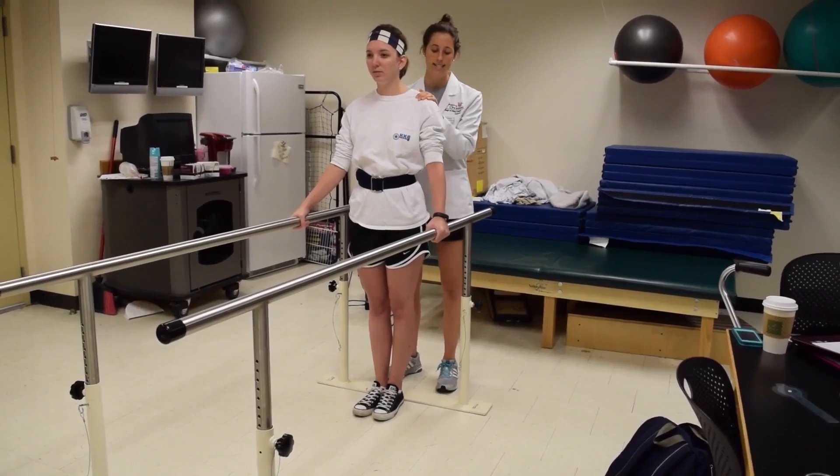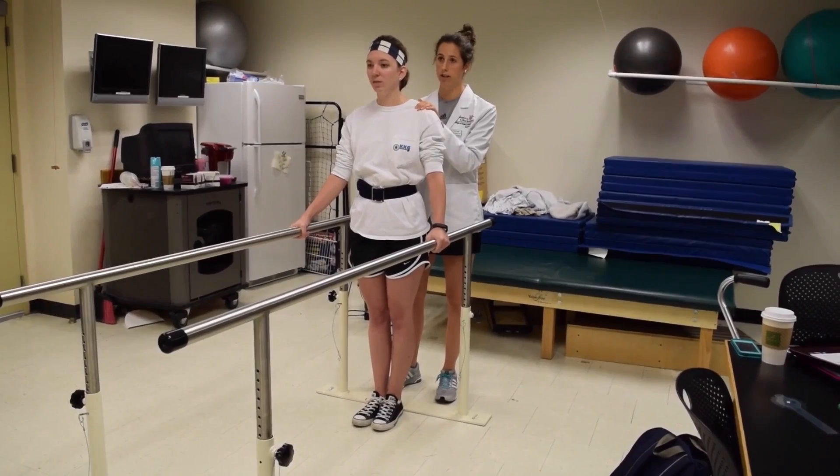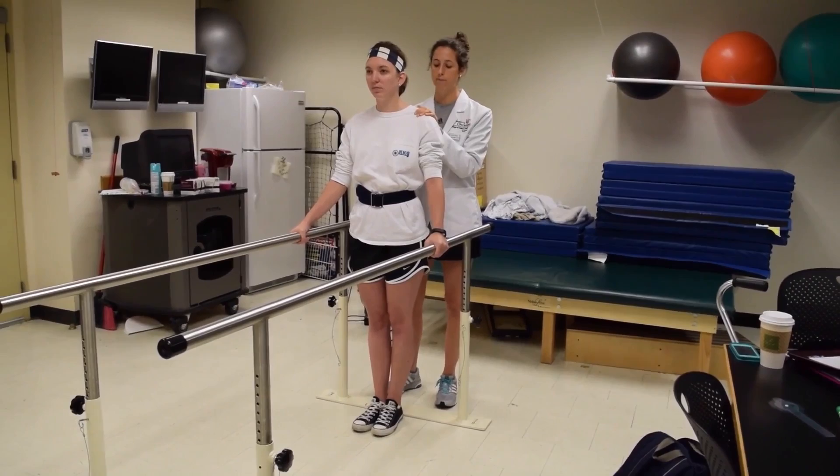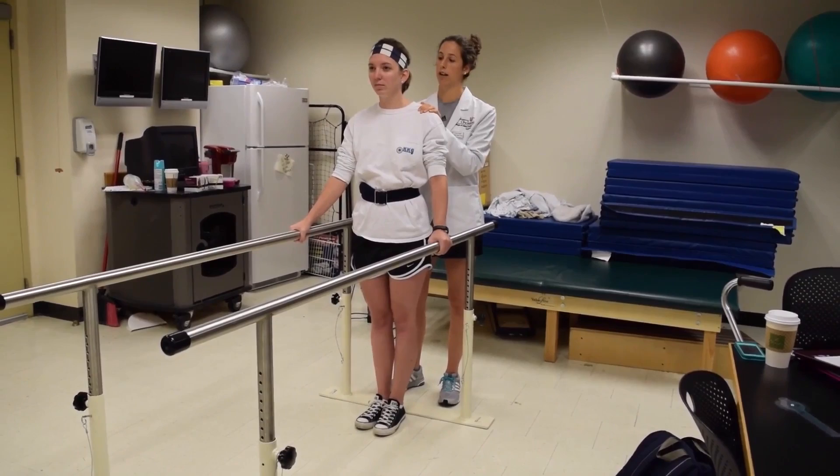Do you think you can do both at the same time? We're going to do that and hold for a count of five. Great, how'd that feel? Now we'll do the other side.